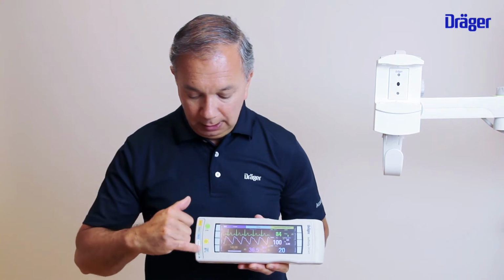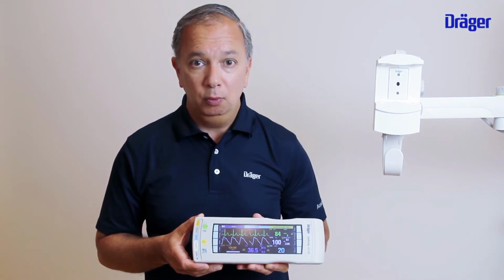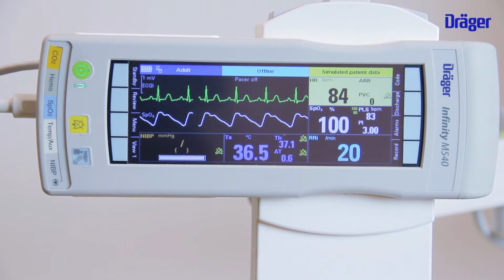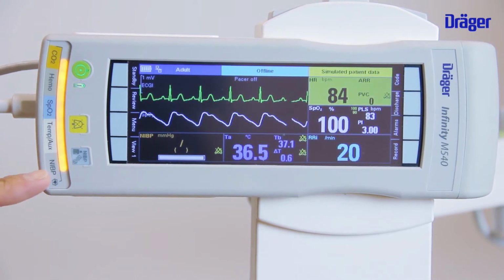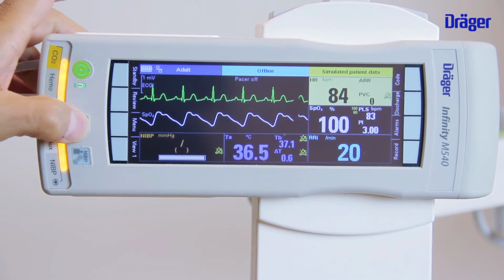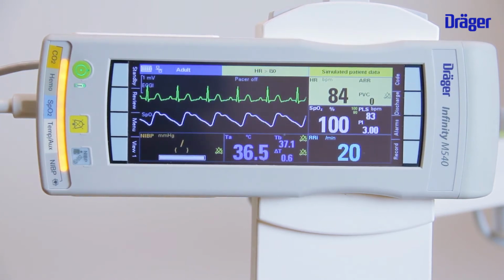On the front, in here, you have the alarm bar. This bar will light up in red or in yellow when a red or yellow alarm will sound. When you have a yellow alarm, you see that the yellow alarm in the alarm bar will light up. When you push the alarm pause button, the alarm will be silenced and you see the light will be static. This will have a duration of 2 minutes.